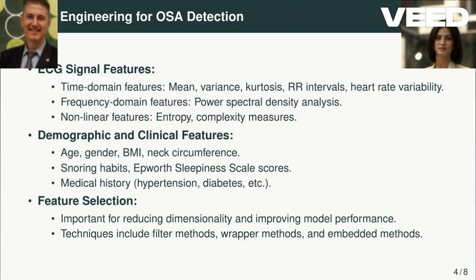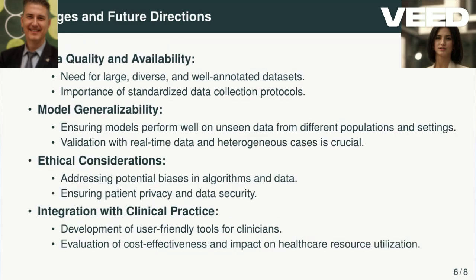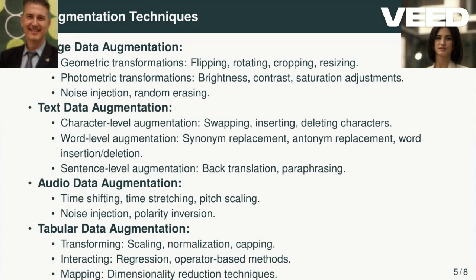Well, think about spectrograms. Those visual representations of sound, researchers have found that CNNs can actually analyze those spectrograms to look for patterns that are related to sleep apnea. So the AI is basically listening to the sounds of your sleep. Exactly. Pretty cool, huh? That's incredible.